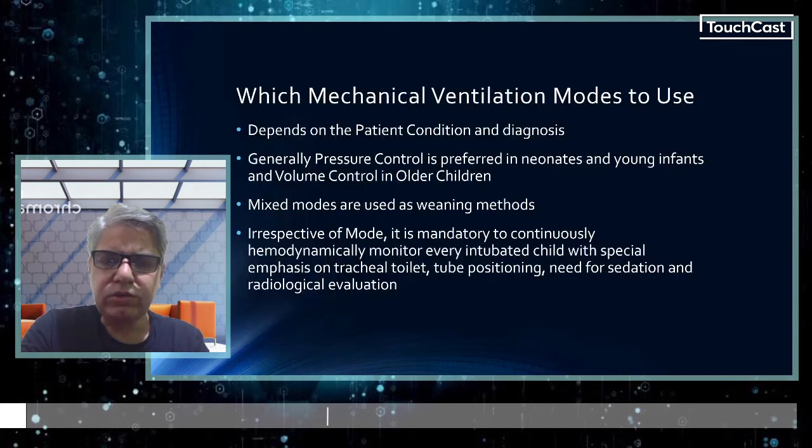Fine. Now, usually the question which is asked to us is which ventilation modes can be used in different conditions. People have got their favorites as well. It depends more on the patient condition and the underlying diagnosis.